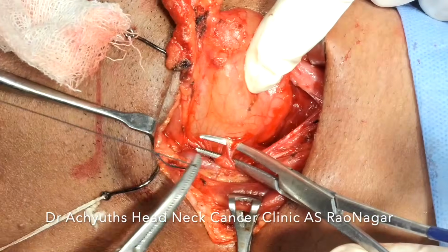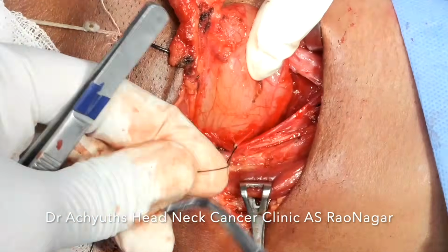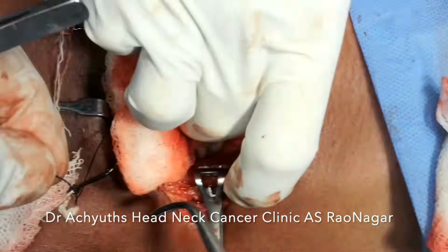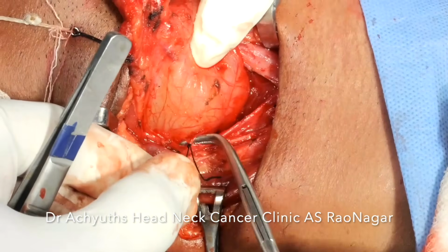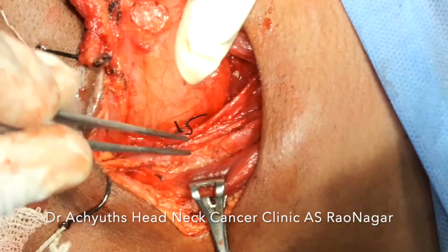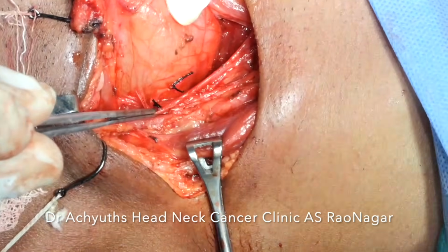So small vascular twigs, they are suture ligated and divided. In resource constrained settings, sometimes we do not even get the free ties.